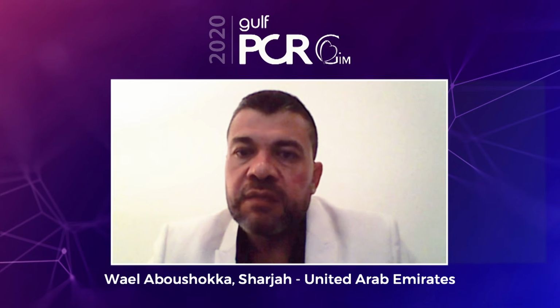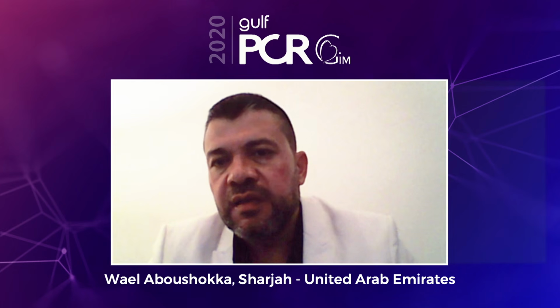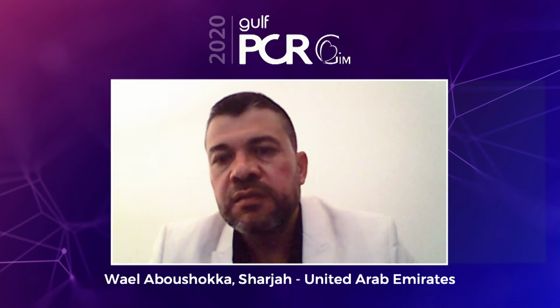So usually, for me, I prefer atherectomy unless there is a contraindication, maybe a single vessel, single remaining vessel, where you are a little bit worried of distal embolization and no reflow. Although we can manage this by using hemodynamic support with an impeller.